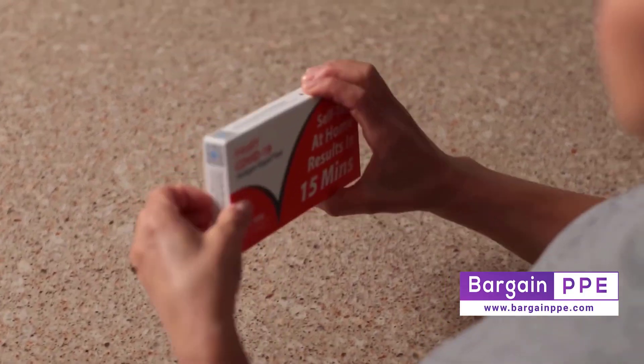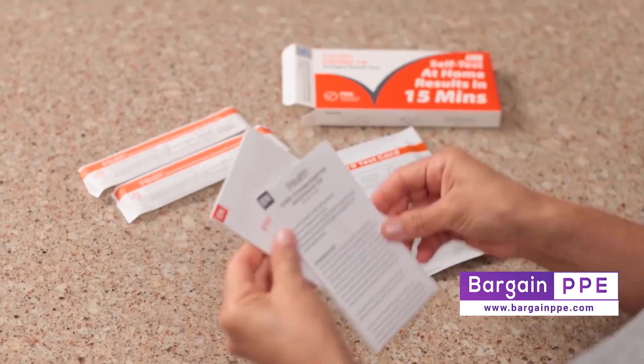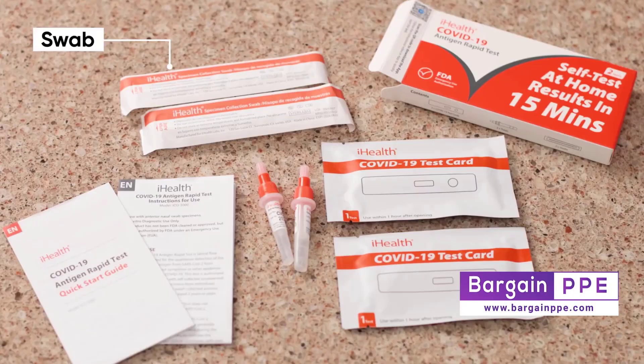Once it's dry, lay out the following items from your kit, but don't remove them from their individual packaging just yet: a swab, a test card, and a test tube.